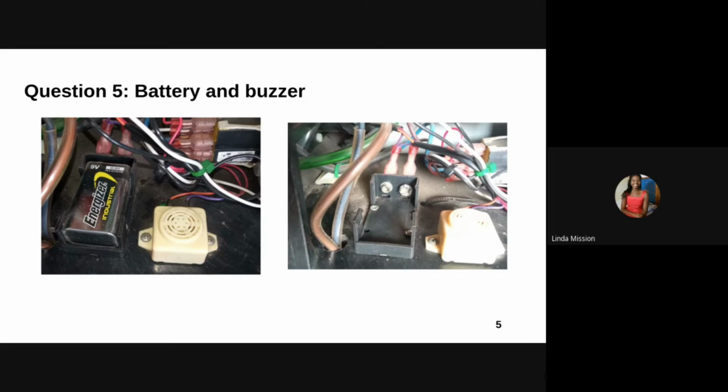And sometimes when the battery has drained and stays for a long time in the concentrator, it begins to release some chemical fluid that causes the connectors on the battery to form rust. If this happens, make sure that you clean the battery terminals before replacing the battery. And if you still don't get the buzzer working, that will indicate that the buzzer is damaged and you should replace it with a new one. So you can see an image of the buzzer and the battery in the graphics as displayed. Thank you, Maui.